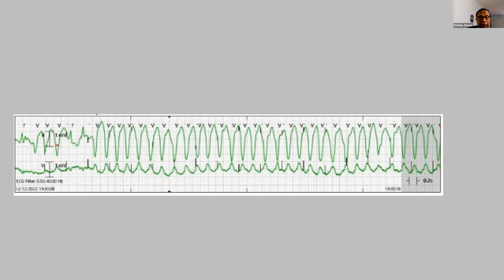So this makes the case very difficult. Please don't forget, this patient has stage 4 pancreatic cancer. So now you stented, develop complete heart block. And the first few beats, some narrowing, this is just initiation of the VT. And then probably there is fusion beat or whatever it is, but it is sustained monomorphic VT.